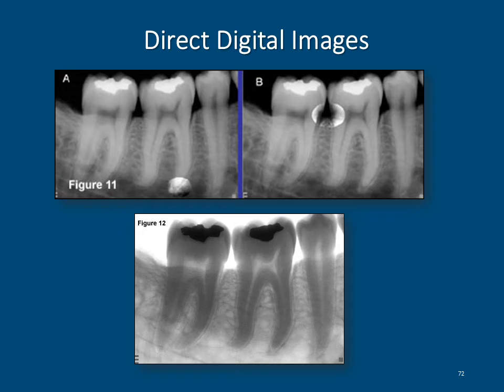These diagrams for digital images show the normal visual on A and B. Figure 12 gives you the opposing or negative of the digital image, and it actually shows the reverse of what black and white or radiolucent and radiopaque images will appear if the negative option is selected. We don't work off the negative option, but it is very good when you're trying to look for particular anatomical landmarks or discrepancies in the film, lesions, things of concern.